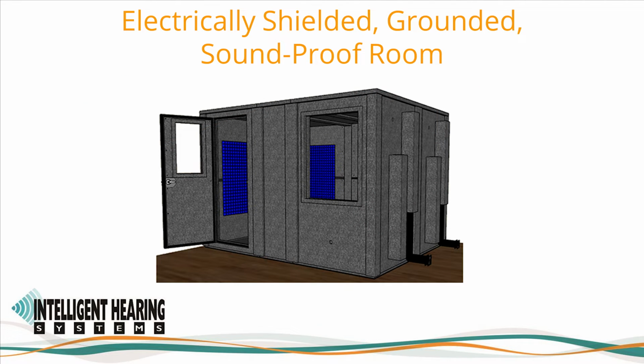The testing environment should be shielded and must be properly grounded. A soundproof room or booth is recommended. Please refer to IHS's techniques for acquiring good quality AEP recordings video and to the Isolation Compliance Smart Note for additional guidance.